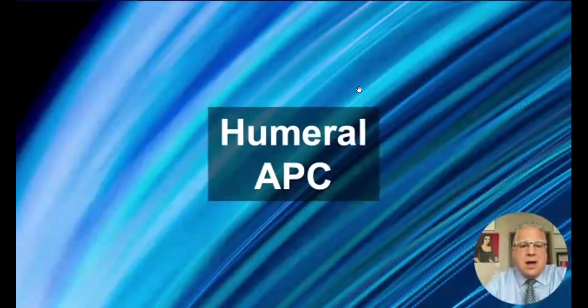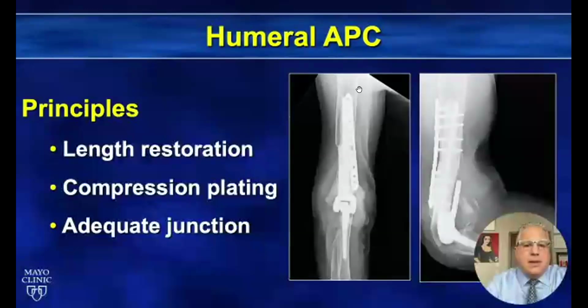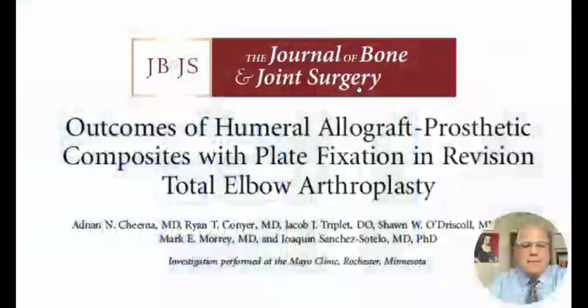Humeral APCs, unfortunately, have been less successful. The principles of humeral APC reconstruction include length restoration, compression plating, and adequate junction. We just reported the outcome of a number of patients that we treated at Mayo Clinic.